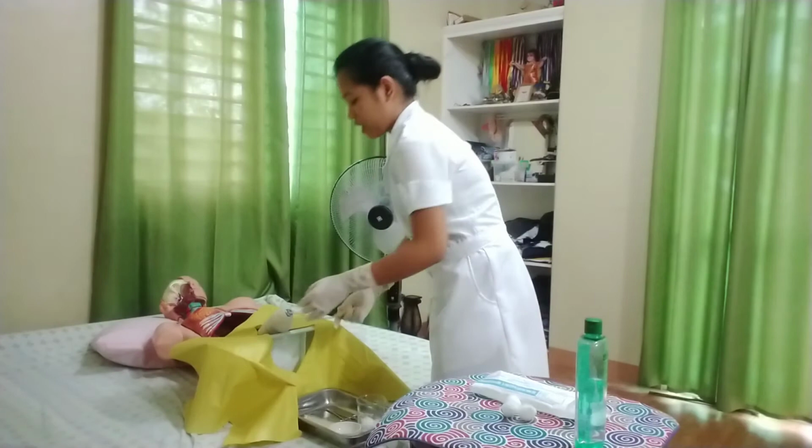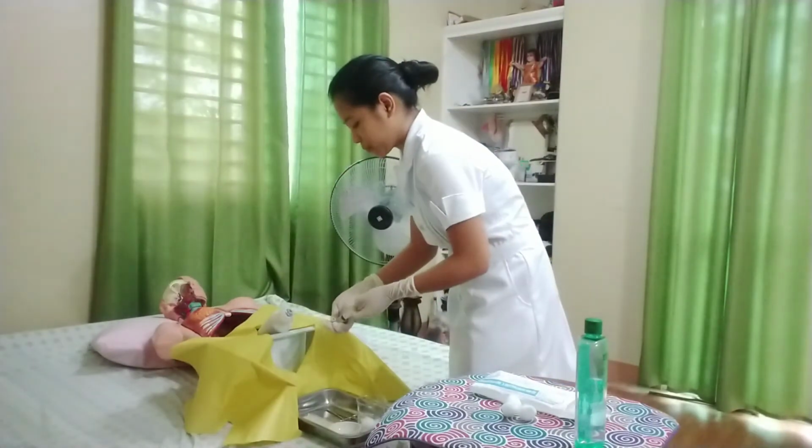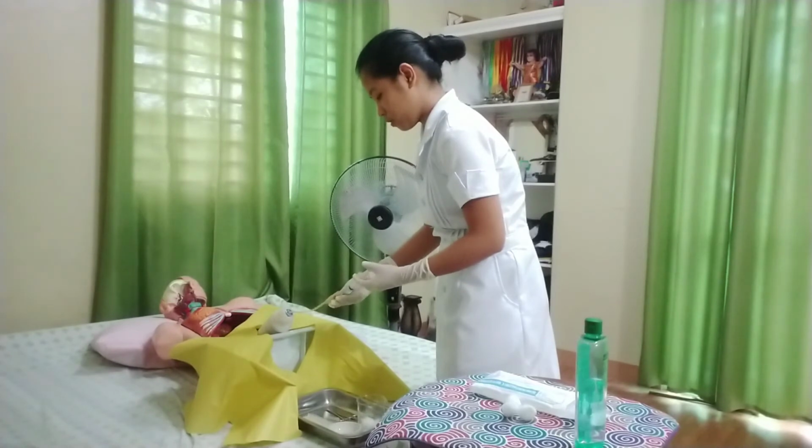So once the catheter is already in, I will now be inflating the balloon of the catheter.